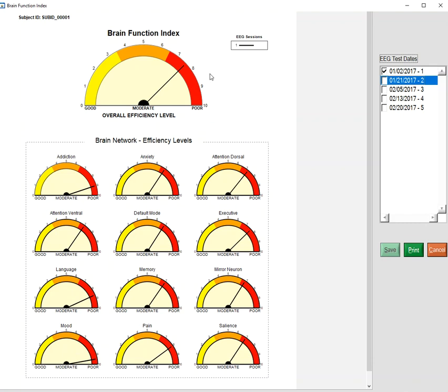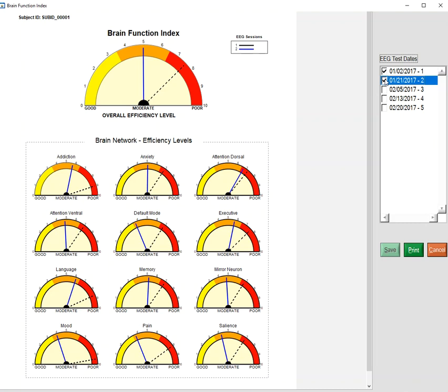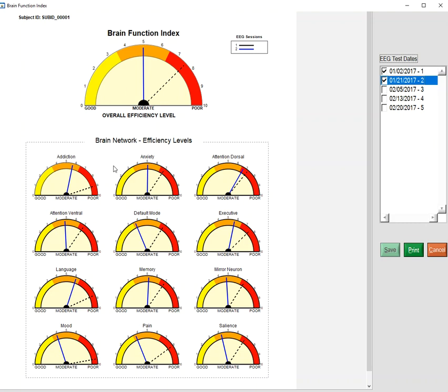Now the individual was given one session of biofeedback, Loretta Z-score biofeedback, and then he was tested again. And you can see he's moved towards a moderate or more efficient level of efficiency of information processing in most of the networks, a little better in the pain network.